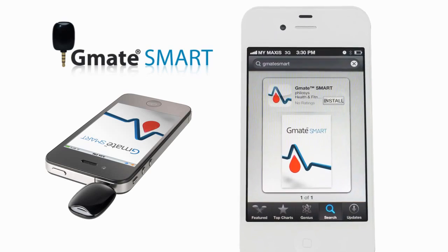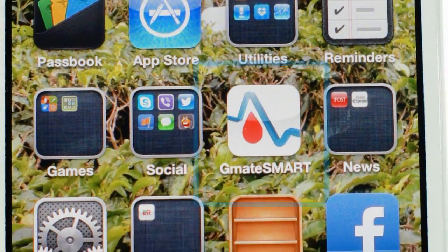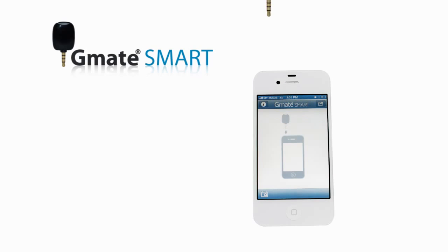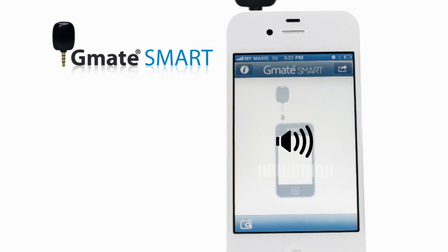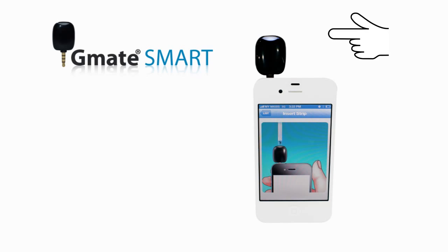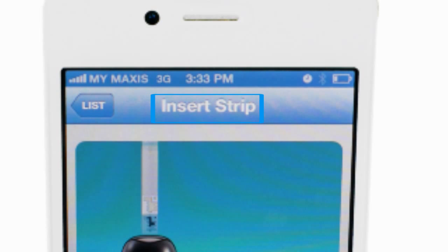Select G-Mate Smart from the list, then tap Install. Tap the G-Mate Smart icon on the smartphone to open the application. Plug the G-Mate Smart meter into your headphone jack. You may see a volume control dialog box appear on the screen — make sure the headphone volume is turned all the way up so that the G-Mate Smart meter has enough power. The white light will turn on and an insert strip prompt will appear on the display.